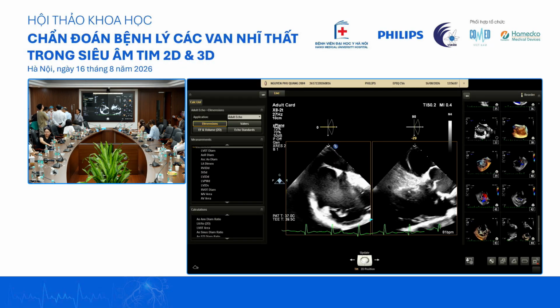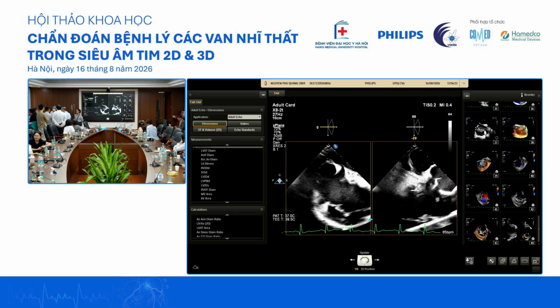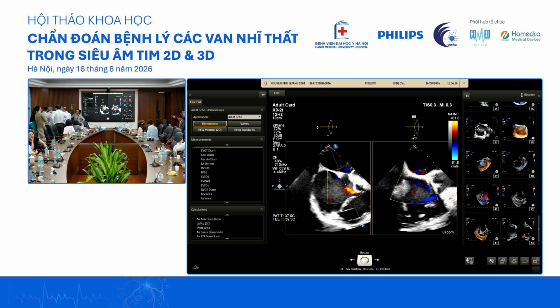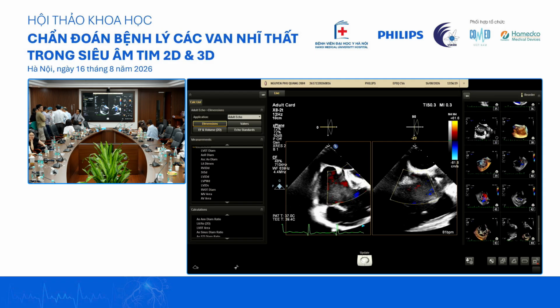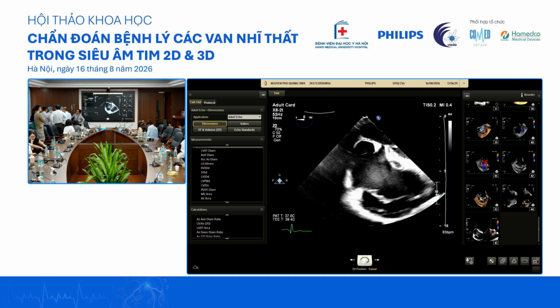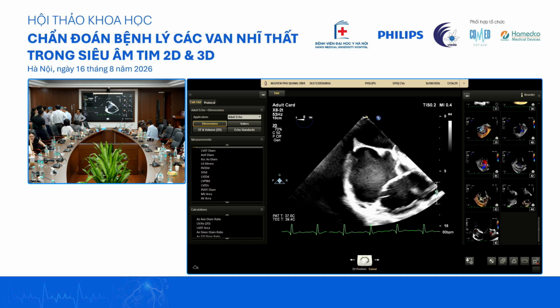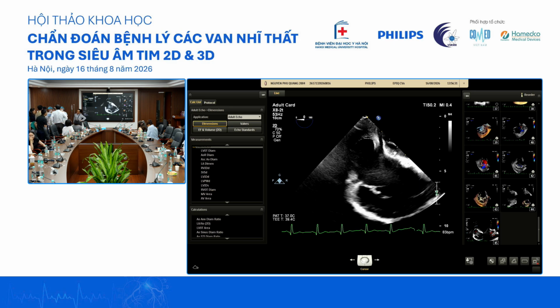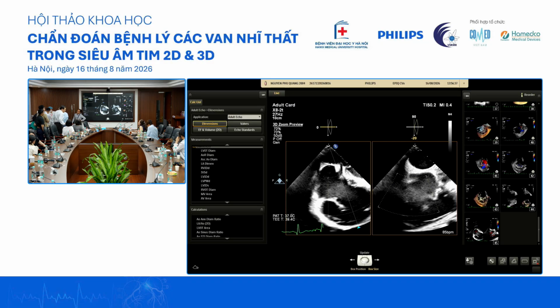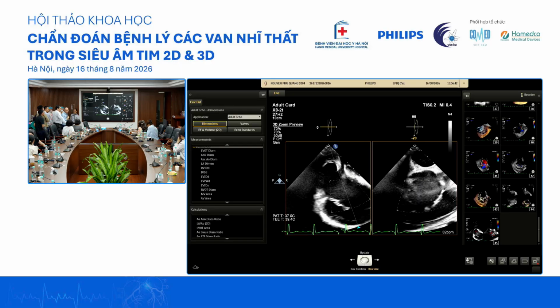It's not coming in. Is that hypoplastic septal leaflet? It looks very deficient, yeah, and that will make it primary. But if you turn on your 3D function over here, zoom, it's very short, really short, correct.